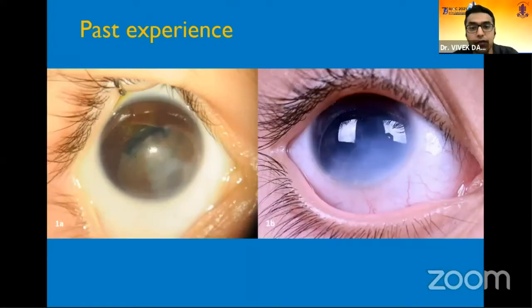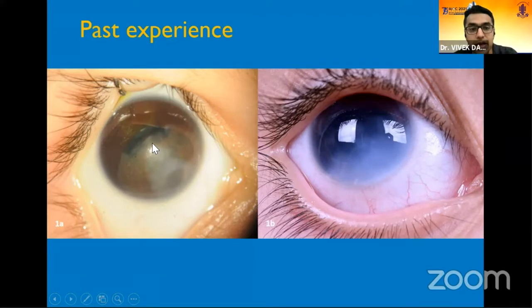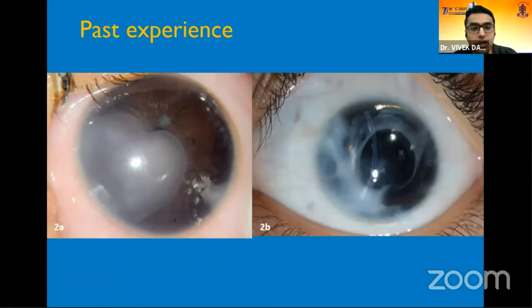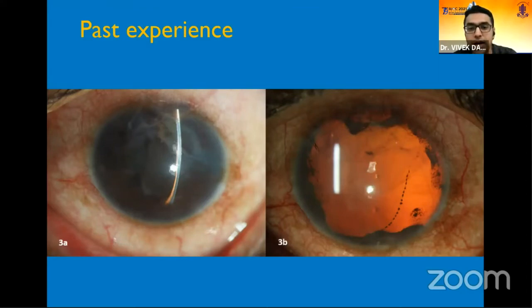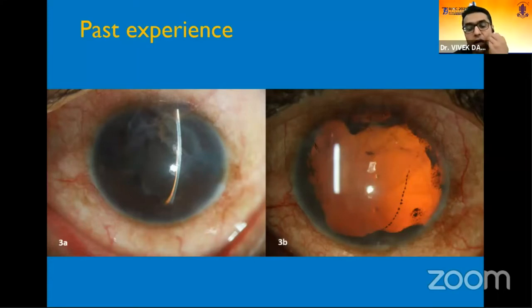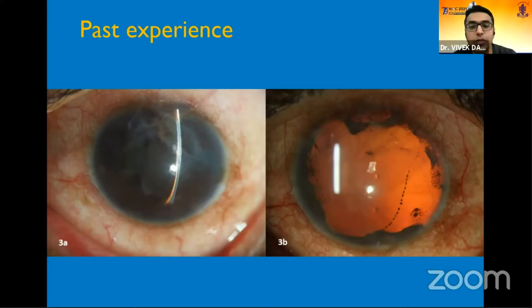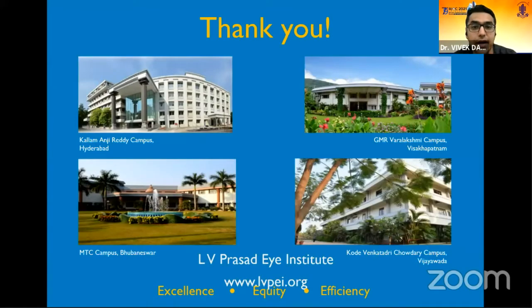A few other cases: one with an iris cyst occluding the pupillary axis in a one-and-a-half-year-old patient showing excellent post-operative results; another with a large heart-shaped cyst extending around the iris toward the ciliary body root with excellent results; and a third with a completely shallow anterior chamber with iris opposed to the endothelium. After complete cyst excision, all three cases showed no recurrence over a follow-up of nine months to one and a half years.